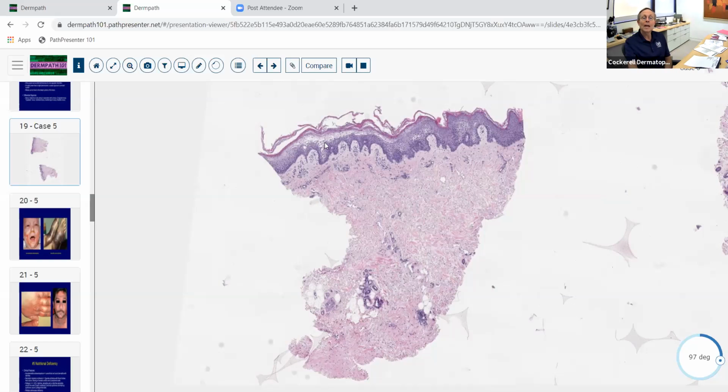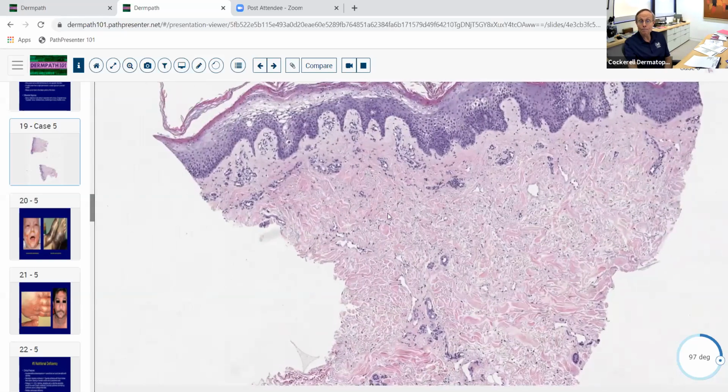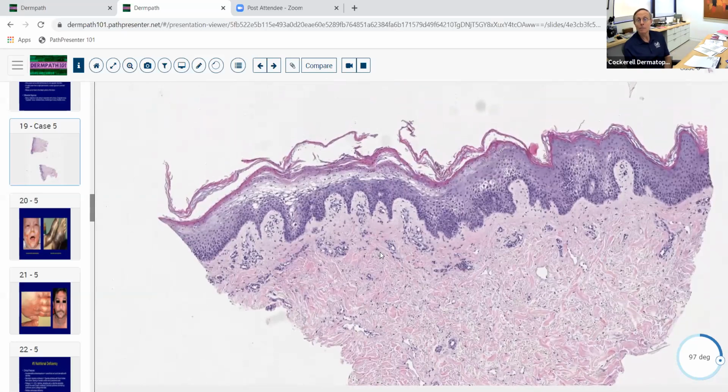So we've got something pale. And notice where it's pale. And so when you think pallor, I want you to be thinking of ballooning immediately. And when you think of ballooning at the top of the epidermis, I want you to always think about nutritional deficiency disorders. So this is one of those A plus B plus C equals D. It's the right answer 99% of the time. Psoriasiform hyperplasia, ballooning degeneration and pallor of the upper part of the epidermis with overlying parakeratosis. That equals nutritional deficiency until proven otherwise. Okay, so that's almost always the pattern.